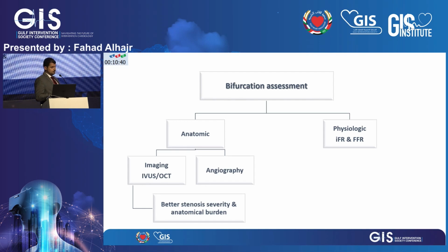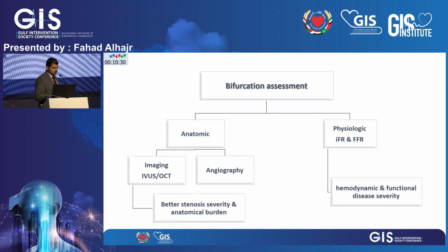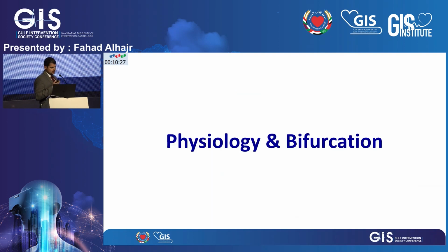The benefit of imaging is better stenosis severity and anatomic burden assessment. For physiology, it will give you more of the hemodynamic and functional disease severity. So this is just to lay the groundwork. I'm going to talk first about the physiology and bifurcation.